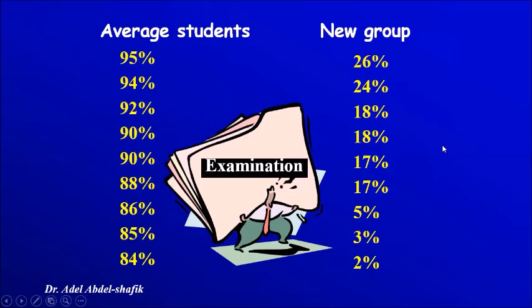In this situation, the position 85% is not affected. This is the normal that we are expecting to be all the time, but sometimes we have this abnormal situation when the 85% position is affected. This will give us a false impression. So we have to remove from our minds that every time we see this area it means generalized affection, and we see this area it means localized changes. No, sometimes it can be a mistake and these local areas will appear normal. So we have to interpret the field comparing with the other examinations, like the examination of the patient and so on. I hope it is clear.